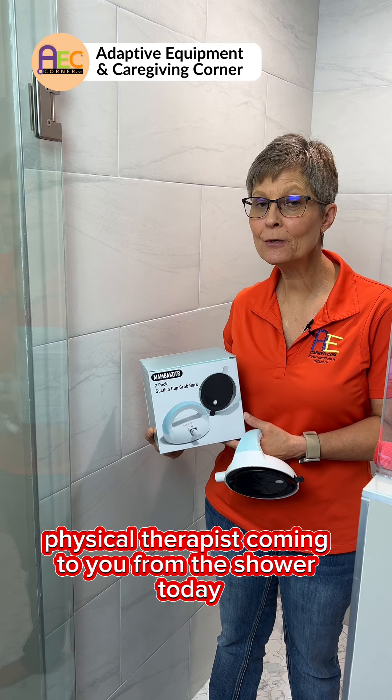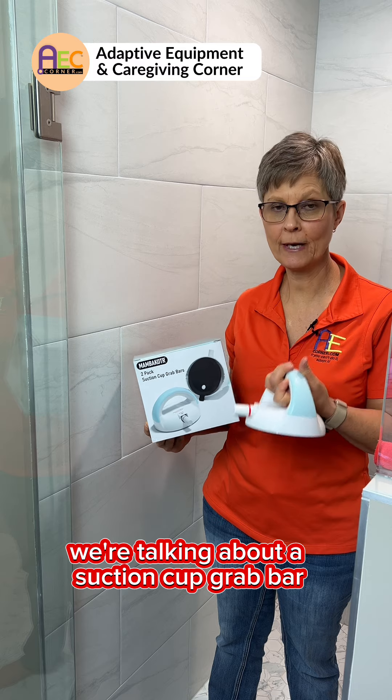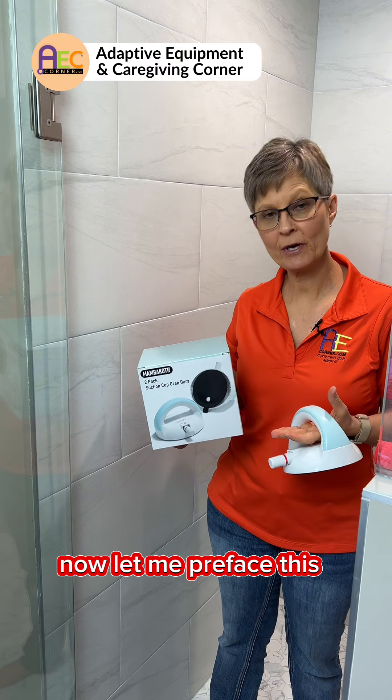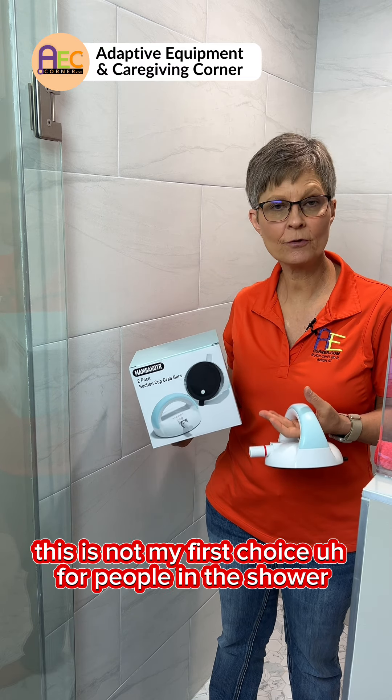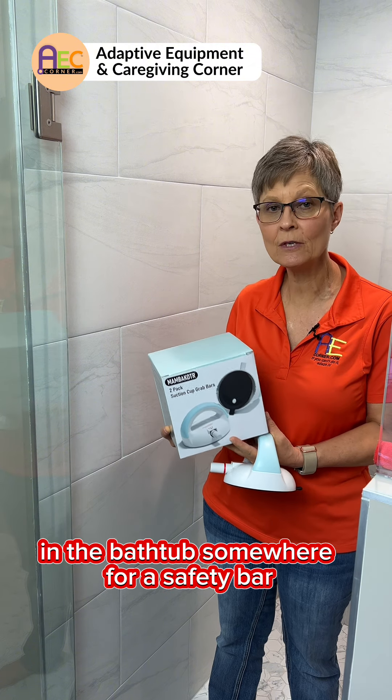It's Cindy, physical therapist, coming to you from the shower. Today we're talking about a suction cup grab bar. Let me preface this: this is not my first choice for people in the shower, in the bathtub, somewhere for a safety bar.